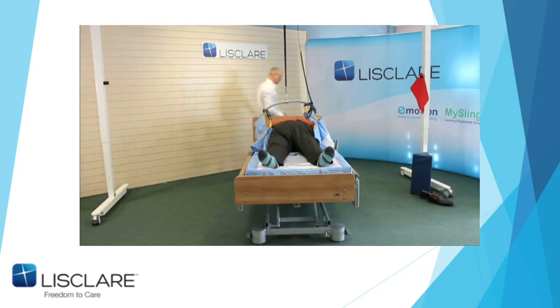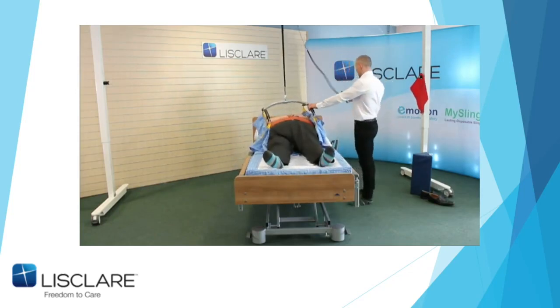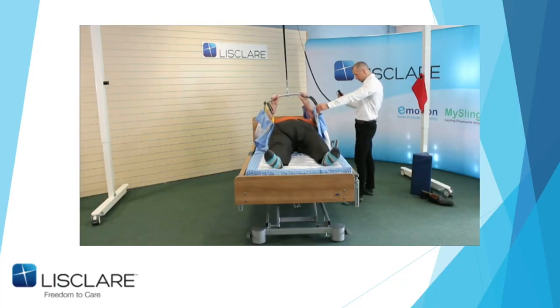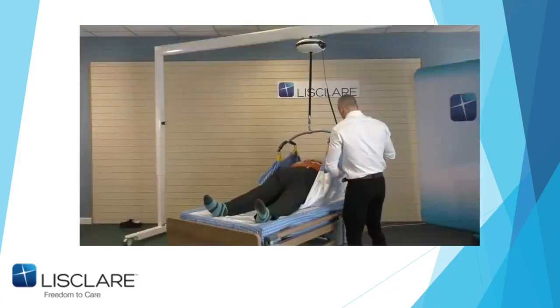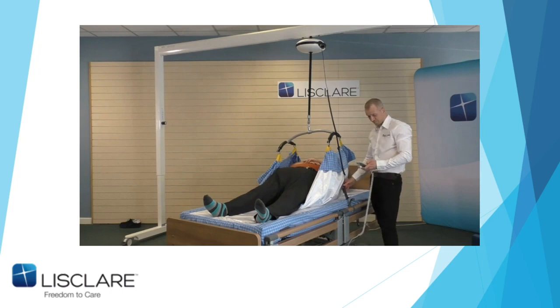So if John comes round, you'll see it acts basically as a repo sheet, okay? And John, all he needs to do is let it take the weight, okay? And because the hoist is nice and at an angle, and before you start there, John, just lift the leg rest off the bed. The leg rest, okay, John? And that creates the slide up.